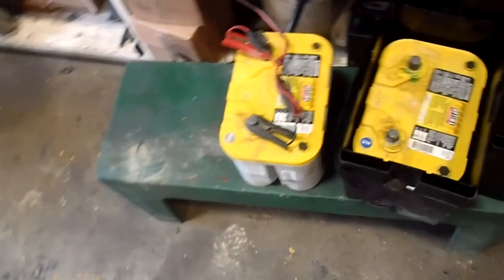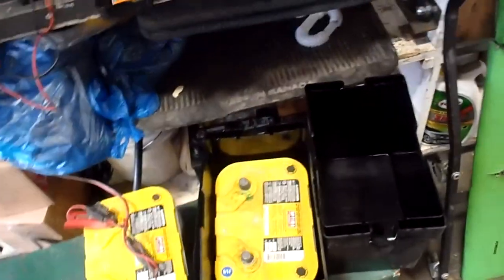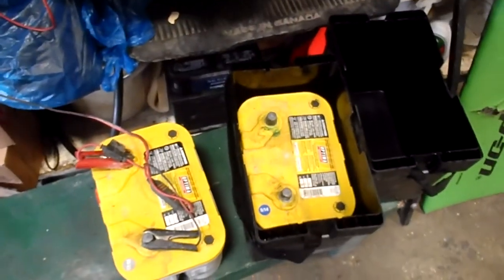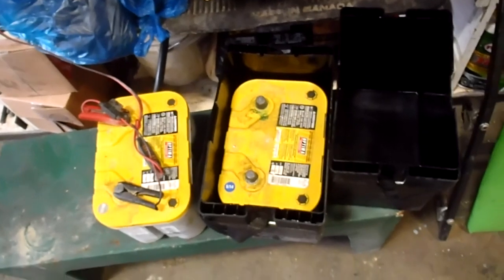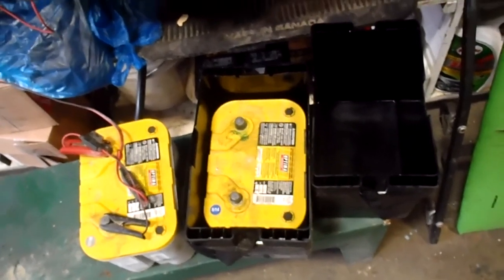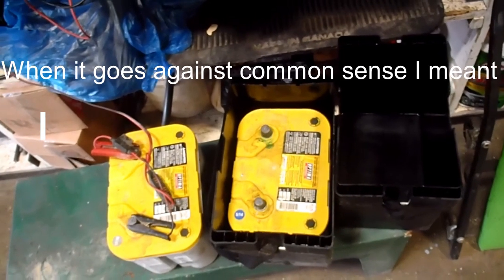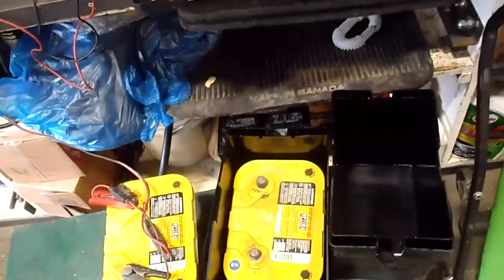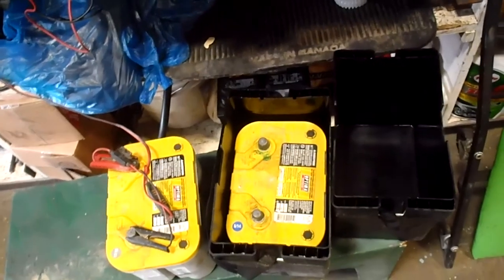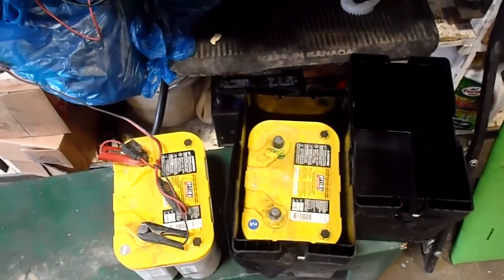I put a new camera battery in, so I'm back. I'm going to show you the electrical. The reason I'm filming this is for people dealing with the healthcare system — they don't want us working on our own stuff. I understand liability to an extent, but when it comes to common sense I don't agree. They're taking advantage of people who are sick, trying to make us buy expensive stuff. Some people in wheelchairs are really handy and can do a lot themselves.